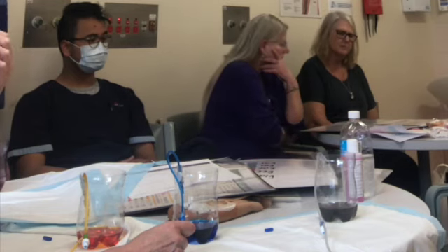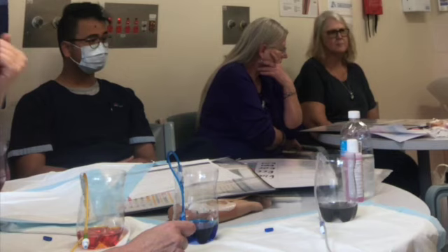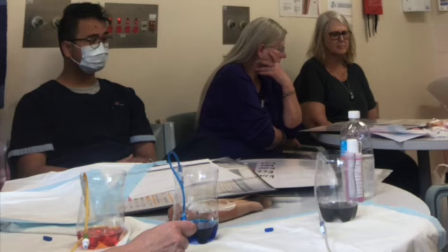Multiple infusions. Little oldies, with little pointy hands. And then other antibiotics that are probably not as harsh. We don't necessarily put in a bag.